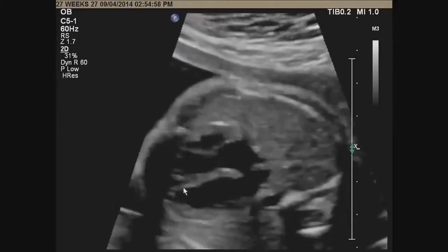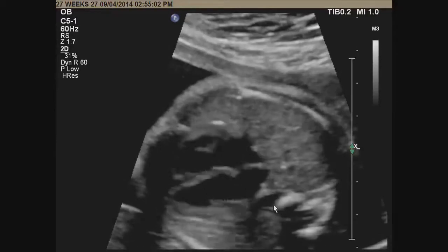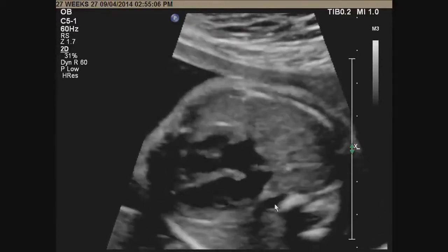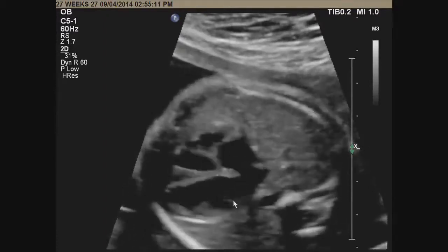Now I'll come back to the pulmonary veins later. But indeed, what's also important, look at the descending aorta. It's on the left side of the spine. No blood vessel between the descending aorta and the posterior wall of the left atrium.